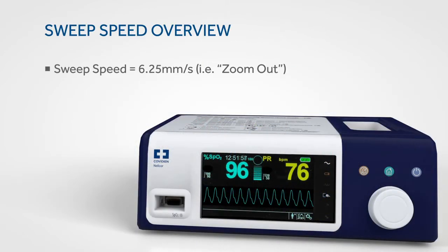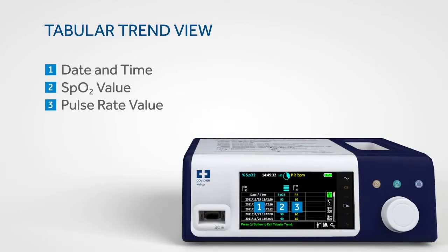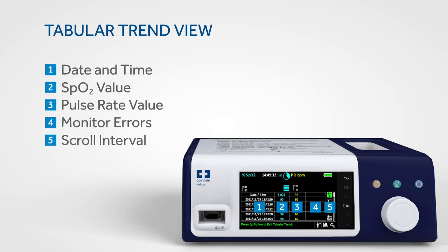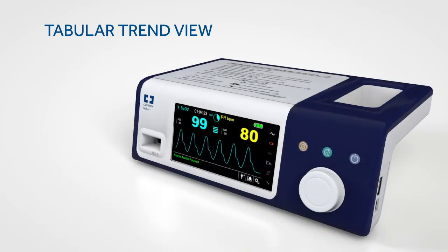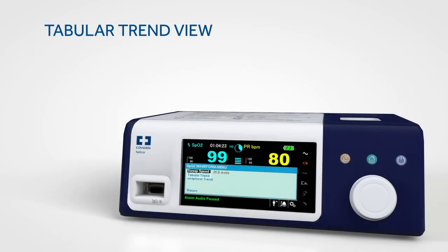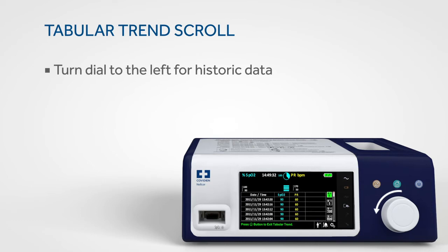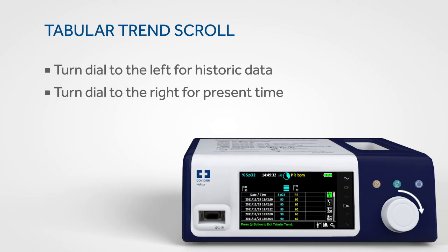The sweep speed view allows you to set the speed at which the SpO2 waveform trace moves across the screen. The higher the sweep speed value, the more granular the data that appears on the screen. The monitoring system presents trend information in tabular format for all monitored parameters when you enable this option. To access the tabular trend view, rotate the jog dial to highlight the waveform or trend display area, press, select tabular trend, and press again. To scroll through the tabular trend view, rotate the jog dial to the left for historical data or to the right to return to present time.